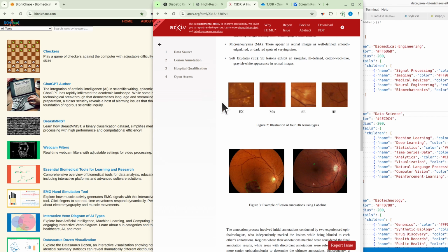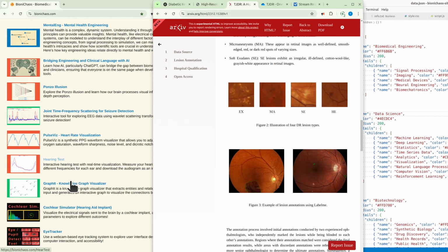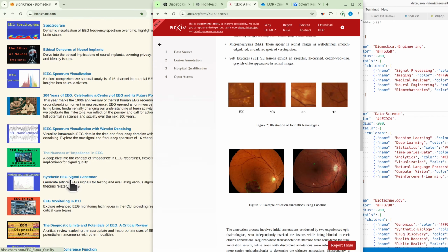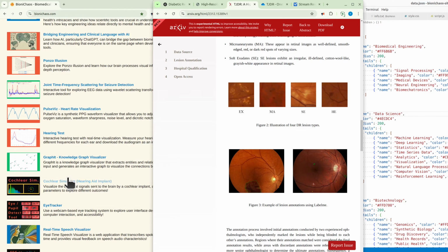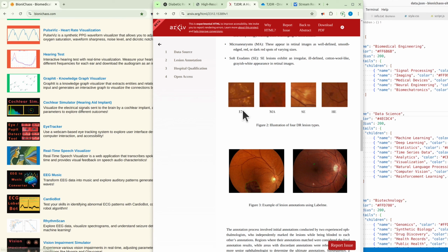My understanding is that if we're doing a convolutional neural network, then it should be searching through the images, looking for similarities, so it will be giving you a percent likelihood of the image to have this type of components, and those would be the abnormalities.